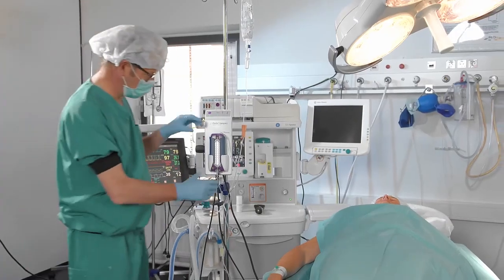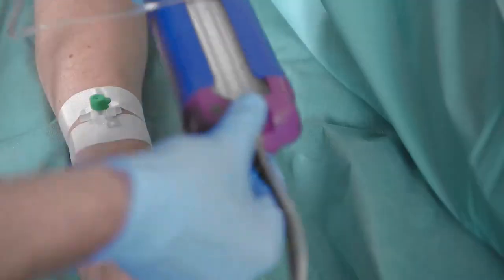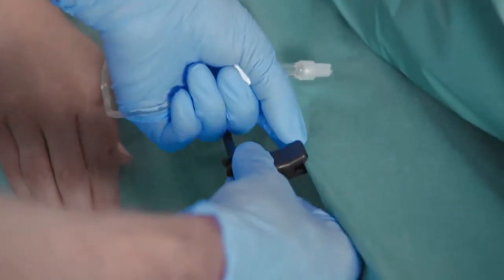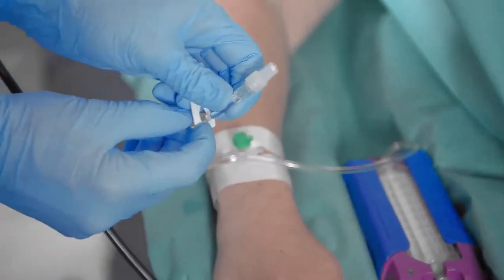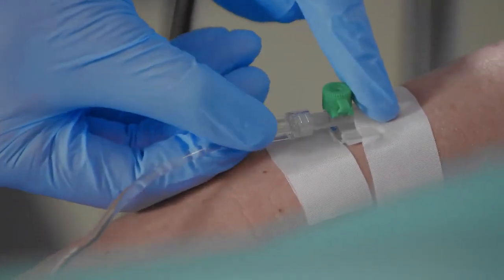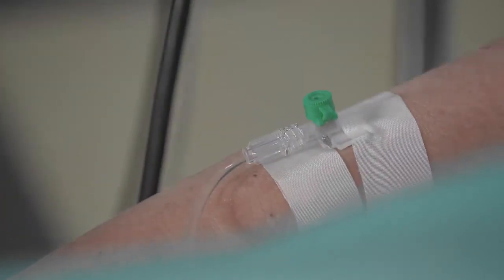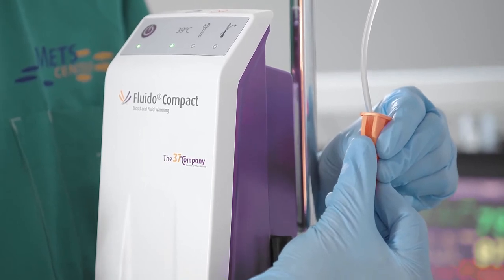Position the warming module near the patient infusion site and secure the cable clamp to the patient coverings. Make sure that the slide clamp is open and connect the patient line to the IV catheter. Now open the roller clamp to start warmed fluid administration.